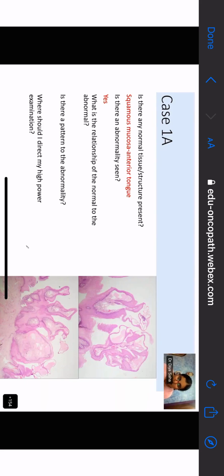Ma'am, this one. That is in the epidermis? You think so? What's surrounding it? Let me ask Vimi. Do you agree with that, what she has drawn is in the epidermis? Ma'am, it's in the subepithelium only, I think. So why is it looking like this, as if it is bloated? Um, ma'am, maybe it is pushing from the epithelial region towards the epidermis.